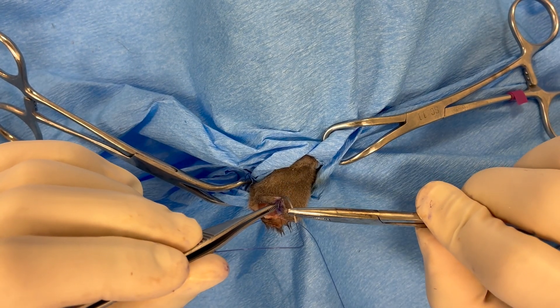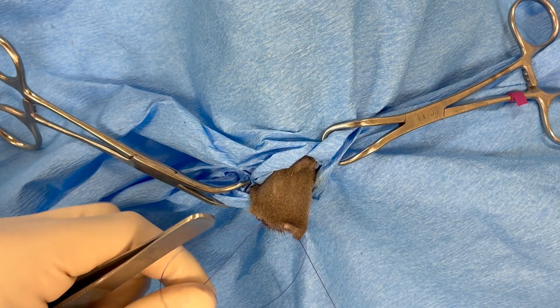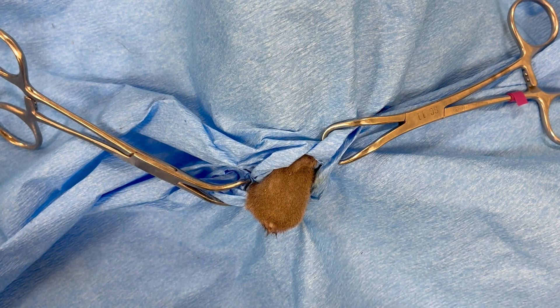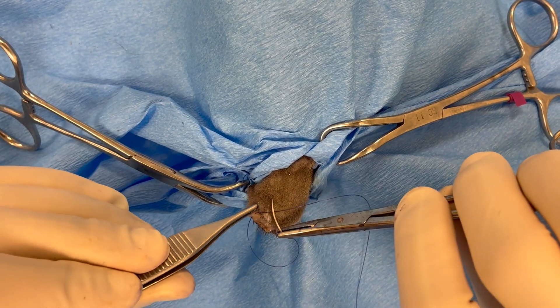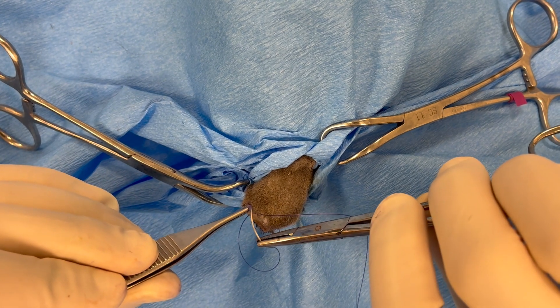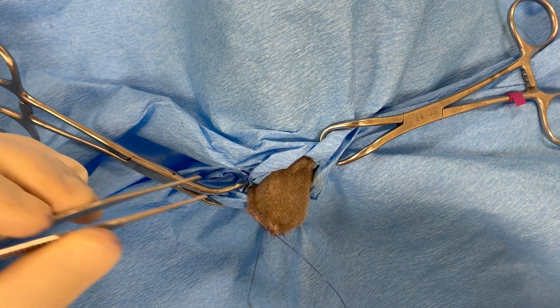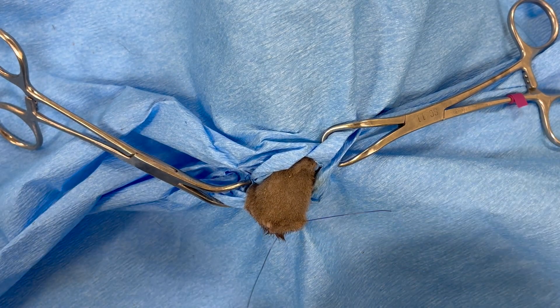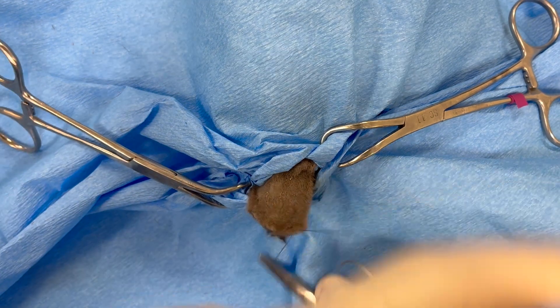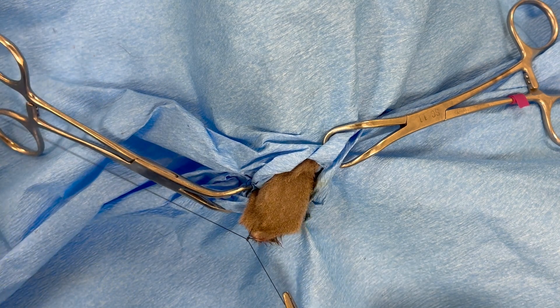For closure we close in two layers: a subcutaneous layer and then a skin layer. For the subcutaneous layer, the knots are buried to ensure no knots are protruding through the incision. An interrupted pattern is used here, but a continuous pattern is also acceptable. And finally, the skin is closed.